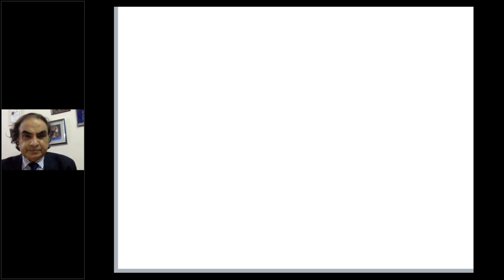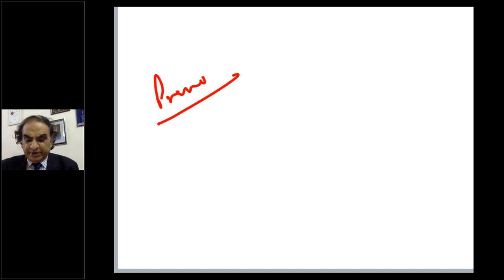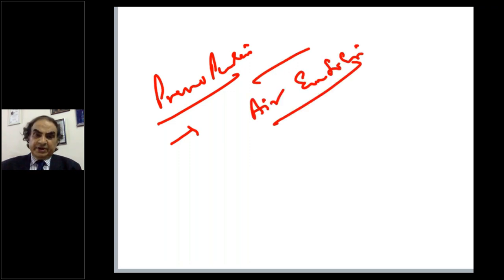Sir, Shantanu is asking, can you discuss complications of pneumoperitoneum and when to abandon laparoscopy during procedure? Well, don't ask me what is copy book. You know the problems in pneumoperitoneum. It can cause respiratory problems, right? But the most important one is air embolism. So I'll take the one which is important. Rest, so many things can happen. You can have diaphragmatic restriction of movement, so respiratory failure is one. Tachypnea.